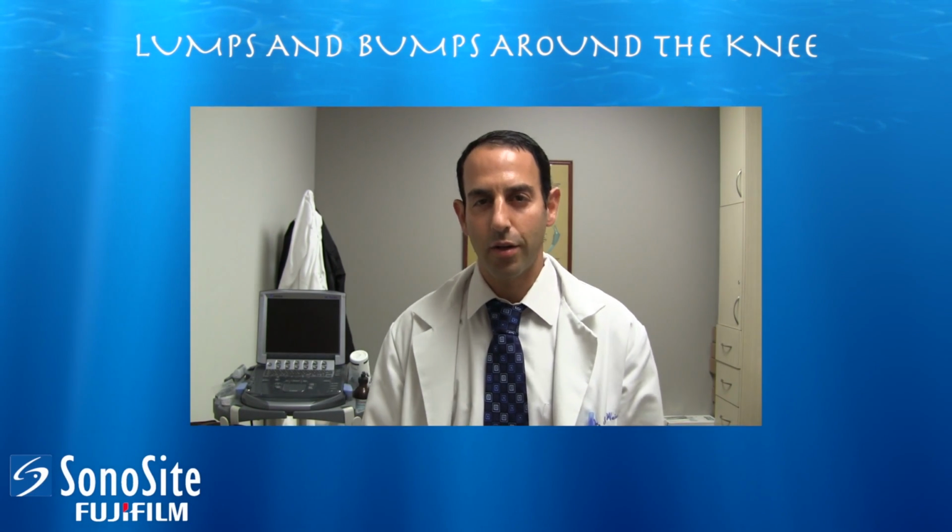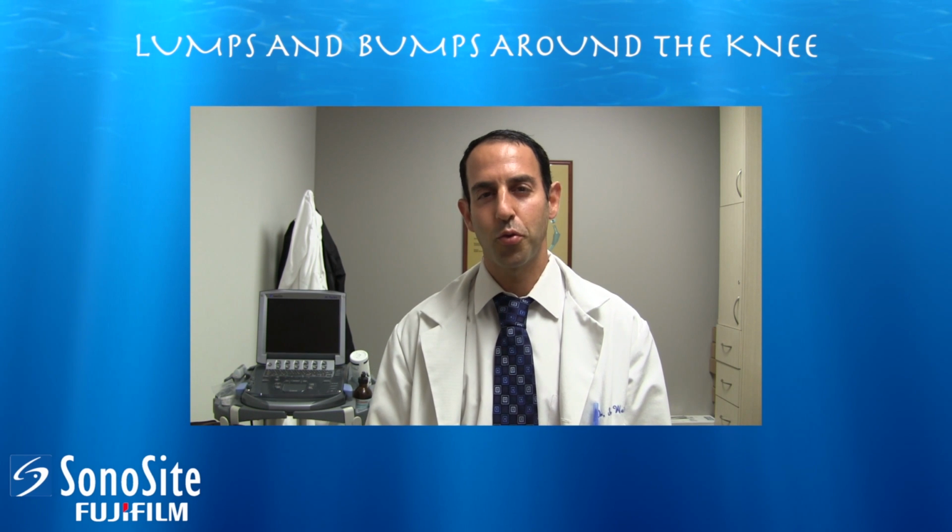Today we're going to talk about lumps and bumps around the knee. I'd like to thank Sonosite for giving me the opportunity to present some interesting cases to you.